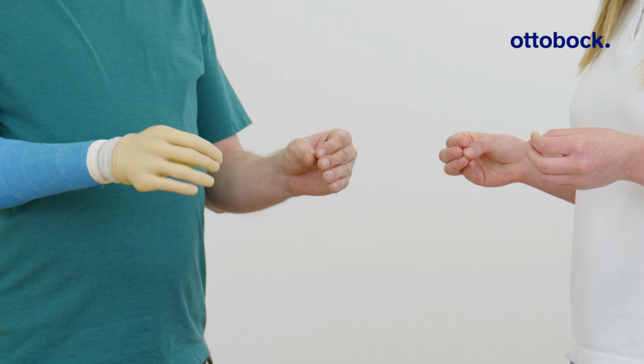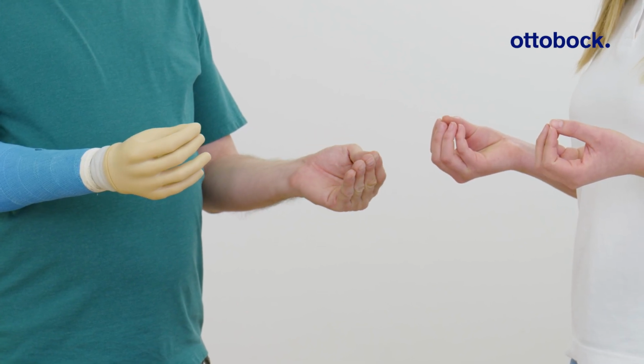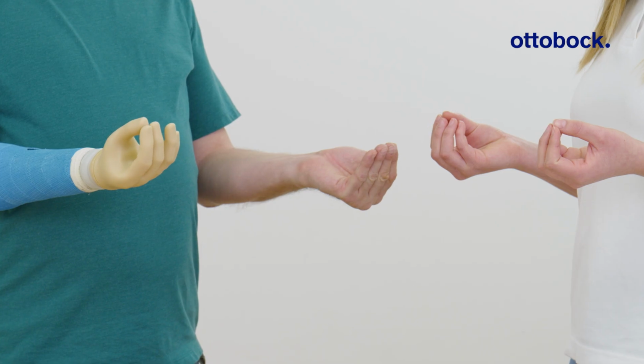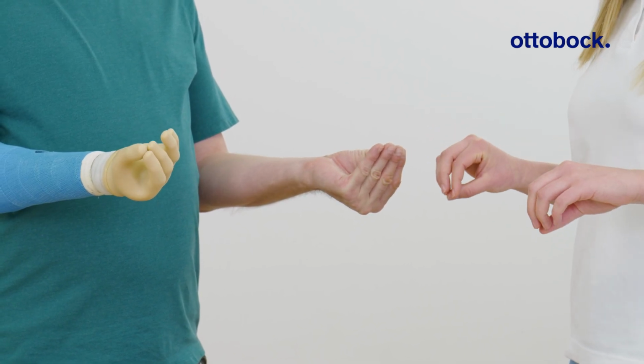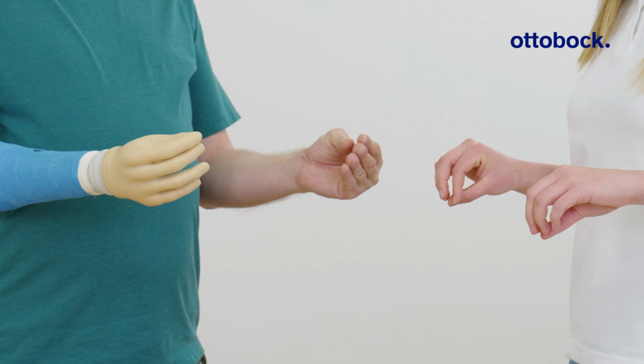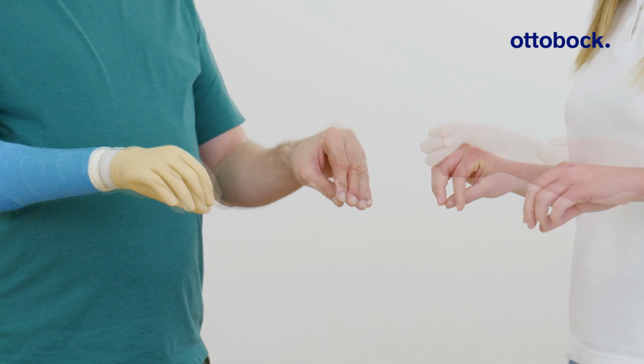Now, switch to wrist rotation. Rotate the hand outward. Then back inward. Controlled, steady movements are key.